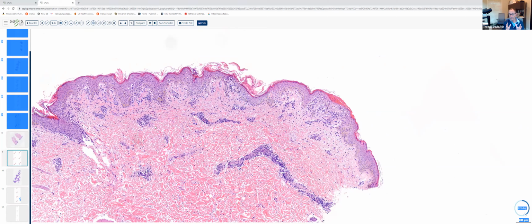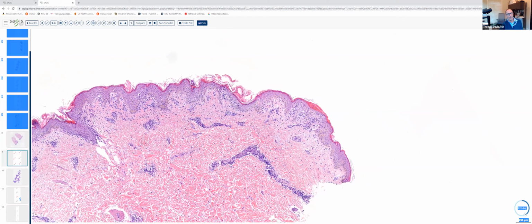The inflammatory infiltrate may be present around the superficial plexus only. One usually can see some parakeratosis, but there aren't as many necrotic keratinocytes along the DEJ, and a lot of times the alterations within the epidermis are more subtle. But this was an example of a biopsy from a patient with clinically documented pityriasis lichenoides chronica.